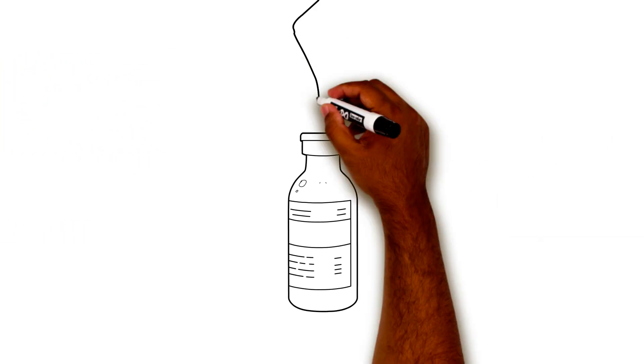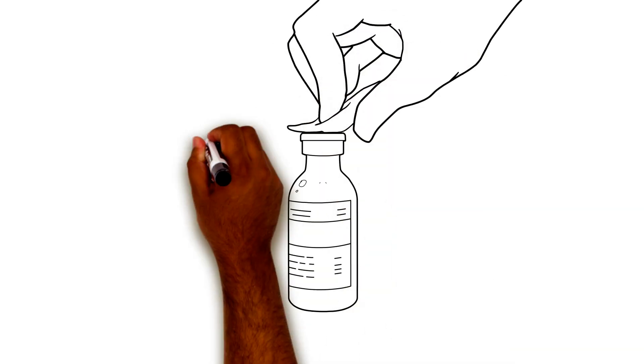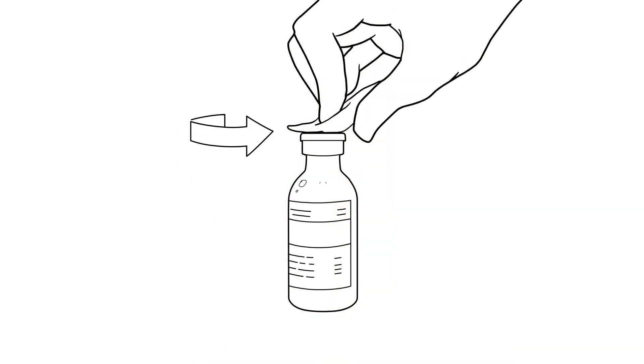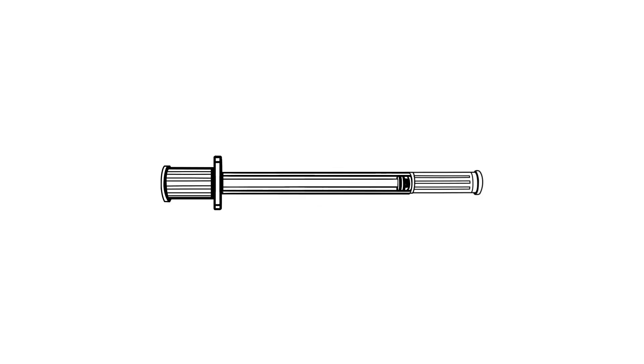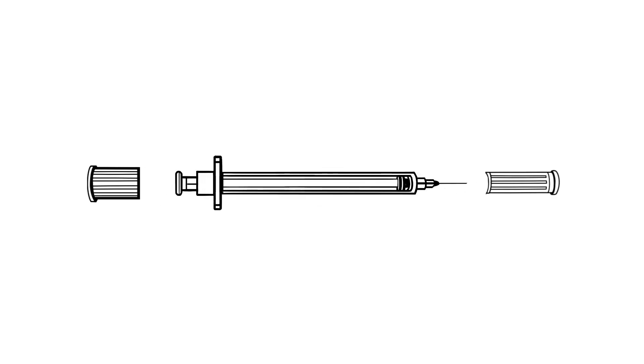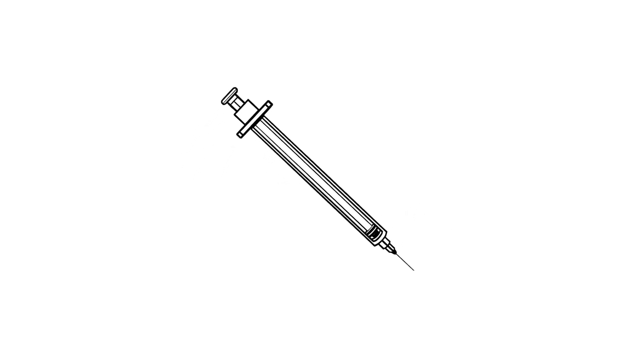Clean off the top of the insulin vial with alcohol. Let the alcohol dry before drawing up insulin. Carefully remove the plunger cap and the needle cap. Do not let the needle touch anything.